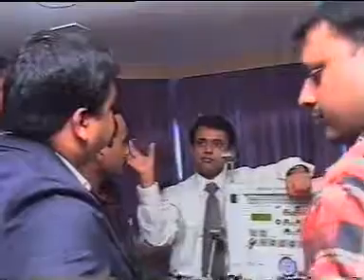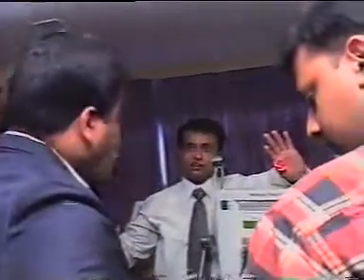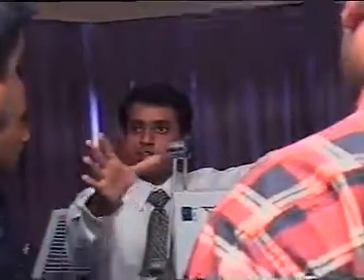You are giving a fixed rate, इतना rate में 1 सेकंड में 1 breath आना चाहिए. तो आधा इंस्पिरेशन को मिला, आधा एक्सपिरेशन को मिला. रेट्स को तुम हाथ नहीं लगा रहे हो, ऐसे ही रहने वाला है. Now you increase the inspiratory time. Who is compromised? Expiratory time.